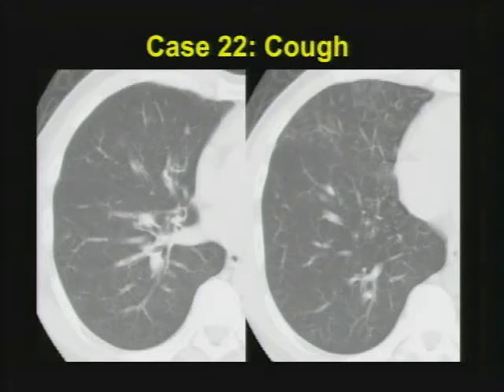Case twenty-two — not the best example of this particular entity, but it shows small pulmonary nodules to good effect. I want you to think: what is your differential when you're seeing nodules, particularly nodules with a branching pattern?